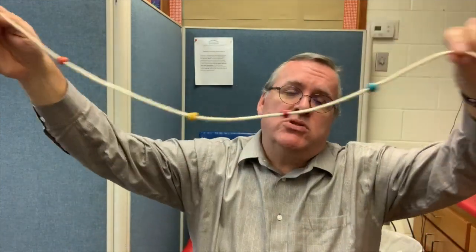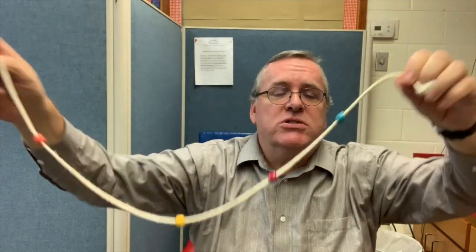Hey, it's Robert Constantine, the vision rehab OT, and today we're talking about the Brock string. The Brock string is a tool that we use to help strengthen convergence in patients that are having trouble seeing up close.